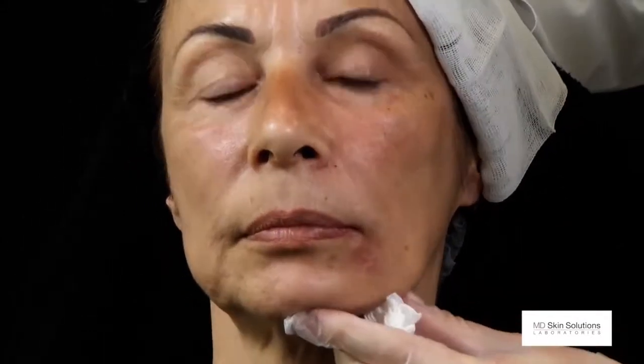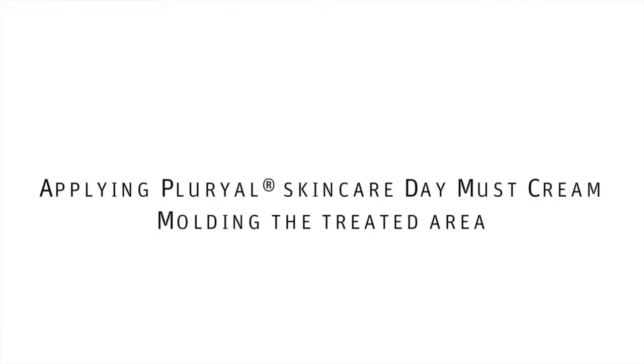I wouldn't use a cannula here because the kind of trauma for the tissue would be far too high. I do immediately mold the area I injected with some Pluryal Day Must cream in order to check what I did.